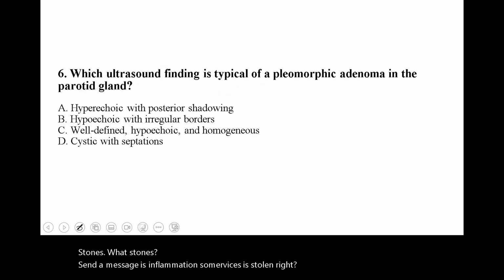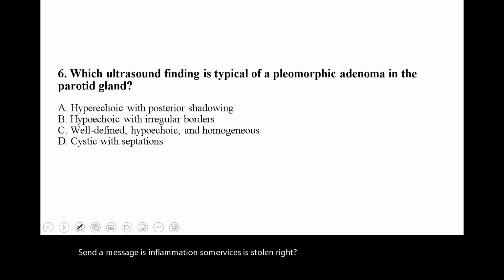Very good. Polymorphic, like multiple shapes. Polymorphic means multiple shapes. Well-defined, hypoechoic, homogeneous.